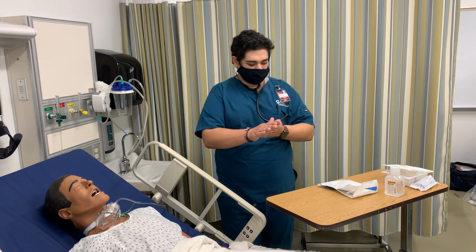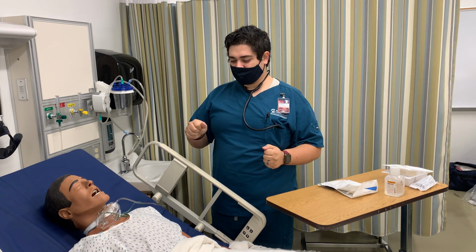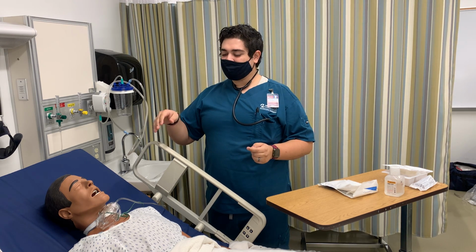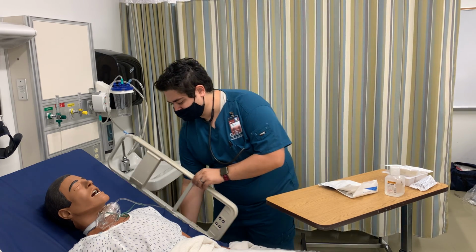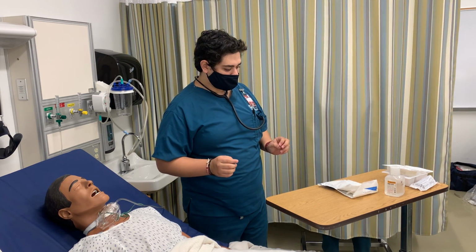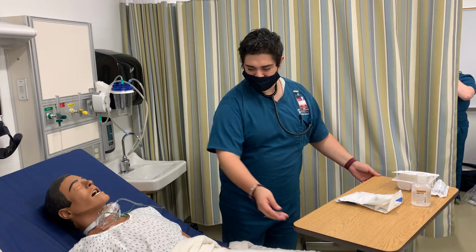performing hand hygiene. Like I said, we will be doing tracheotomy care, seeing if there is a need for suction, cleaning out the stoma, your inner cannula, and replacing your old trach ties. I will lower this. Do you have any questions? Nope. Do you have any allergies? No, not that I know of. Okay, so I will just be positioning my equipment here really quick.